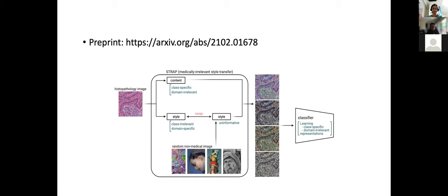Rikiya, I have one quick question. I agree with you that this kind of style model is not really only changing the color, but probably adding some more structural information to your images. So have you thought about computing the structural similarity index between the images?